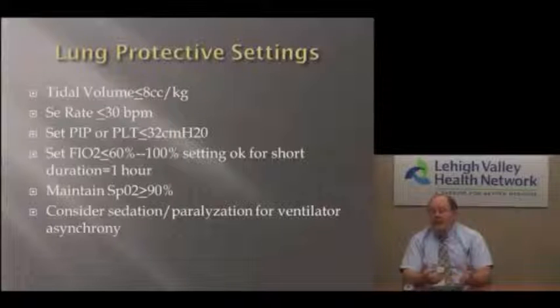And again, as I alluded to a few times during this presentation, consider sedation and paralyzation for ventilator asynchrony. If you have a patient on a ventilator and they are fighting the ventilator and you cannot get ventilation into them, and you've tried to adjust the ventilator settings, you will think about having to use paralyzation. It's an evil word sometimes today because it has some negative consequences, but in the short term, the New England Journal of Medicine showed that in ARDS patients, paralyzation for the first 48 hours improved patient outcomes and decreased ventilator duration. So I think there is a place for full sedation and paralyzation, but if ventilator changes aren't working, and especially in your environment, if you're flying somebody or in an ambulance, you can't have them thrashing all over the place. So I think that's another option that sometimes is missed.